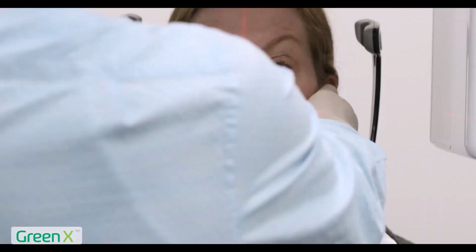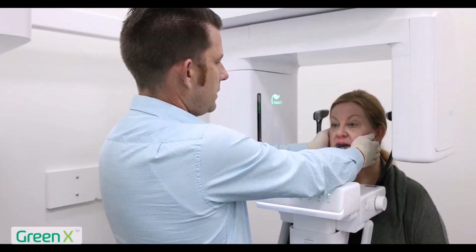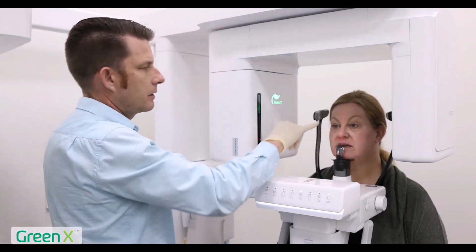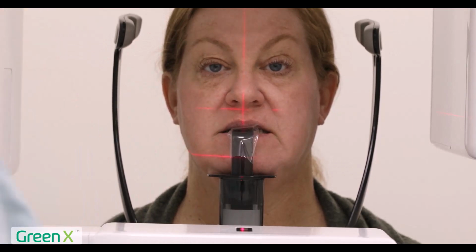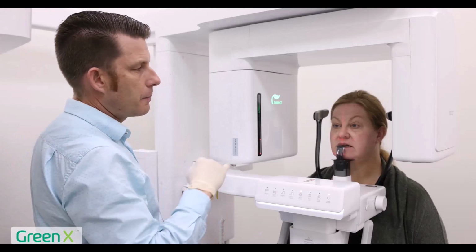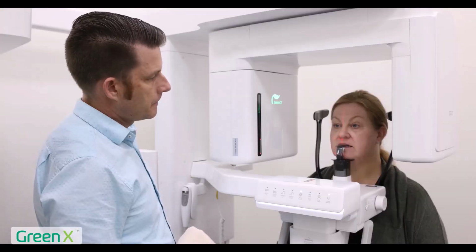Next we will move and go ahead and just gently open. And I'm just twisting you this way. There you go. Go ahead and close. I have the patient lined up center, right between the eyes, right through the philtrum. In this case, my goal is to capture tooth number 9. So we're in the maxilla. You can see the horizontal beam in the maxilla.